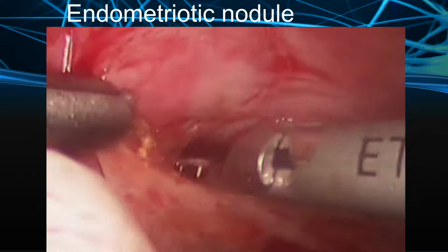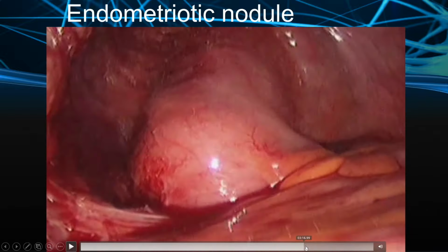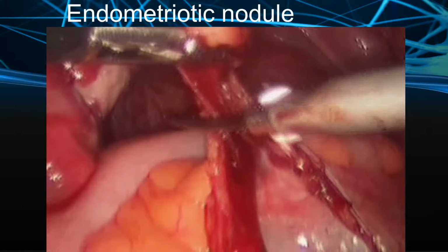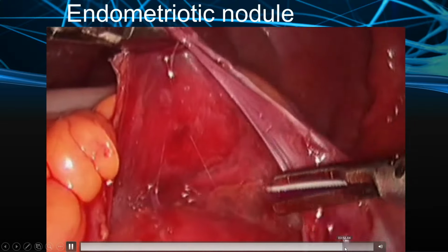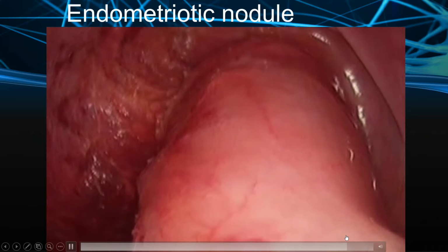So, this is also a beautiful procedure which can be performed, and at the end again all this peritoneum is removed the same way, one by one you will see the nodule and you will remove it wherever it is, and then the entire endometriotic area is stripped out.